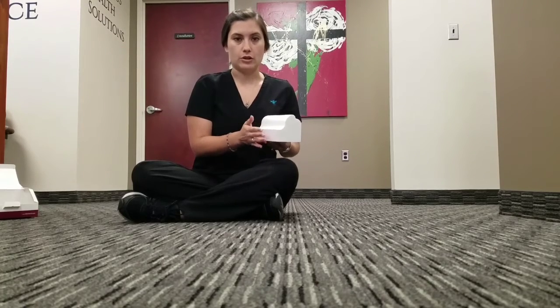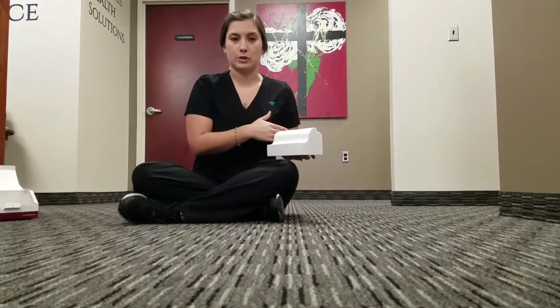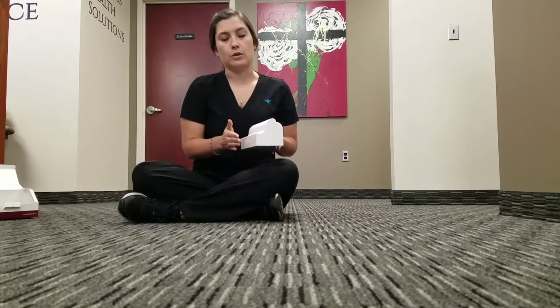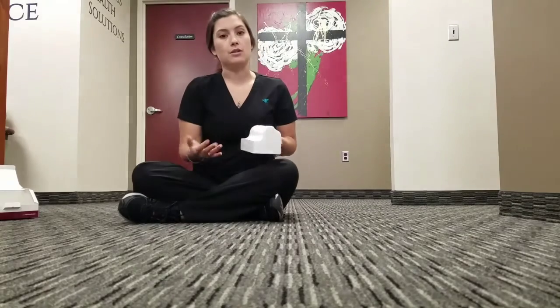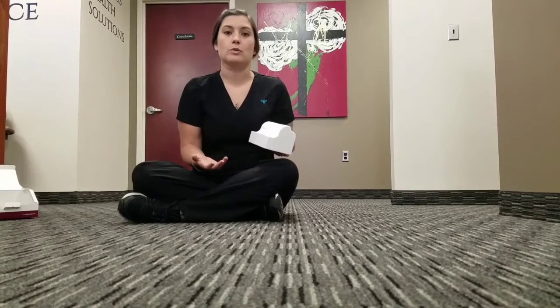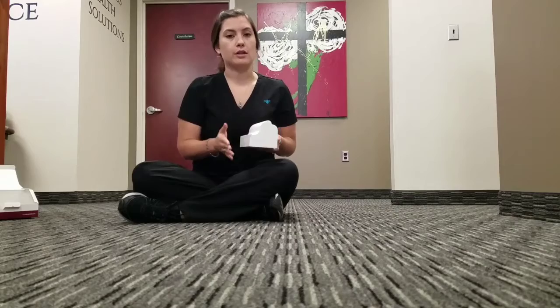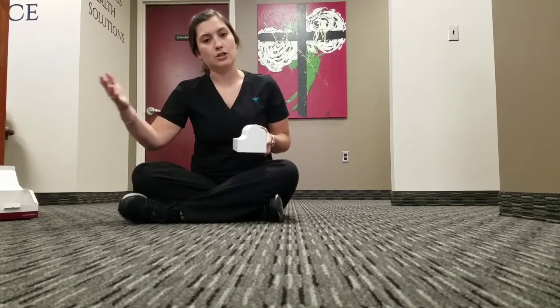So when you lay down, you're going to start with just 30 seconds for the first time that you do it. After the 30 seconds, you'll get up properly, which I'm going to show you how to do. If you notice any soreness or discomfort after the first 30 seconds, that's okay. That's normal, because what we're doing is rearranging some things in your body, and it's normal to be a little sore. But if you notice soreness, you're going to stay at 30 seconds per day until you don't have soreness anymore. Then you'll increase slowly, going up by 30 seconds each time.